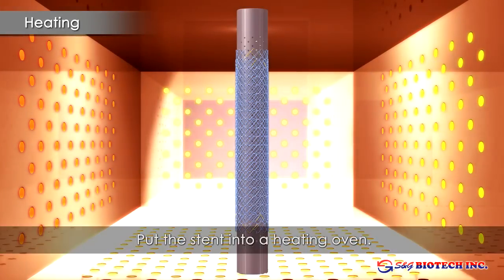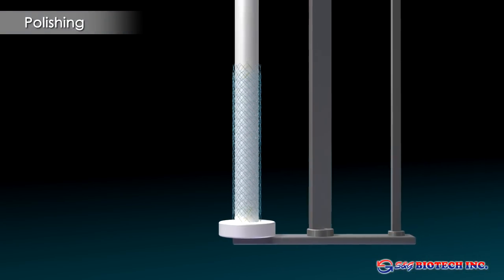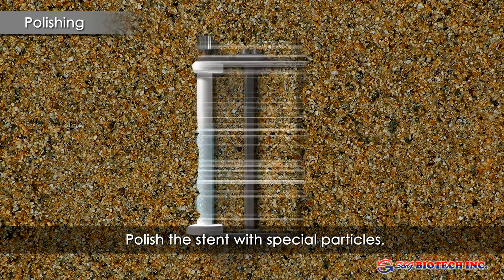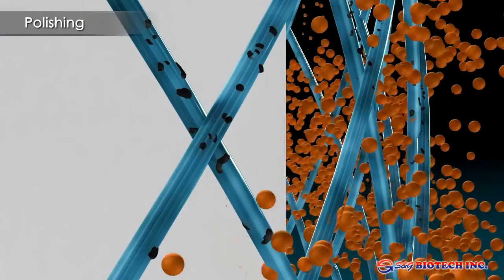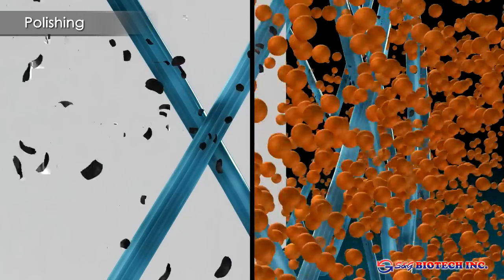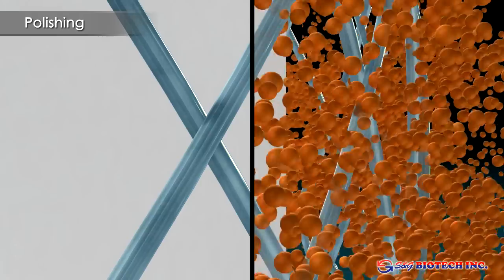The basic stent construction is heated in an oven to imprint the shape memory into the metal. After the heating process, the stent is polished by rotation through abrasive particles. This specialized process reduces microcracks and removes impurities and residue from the stent surface.